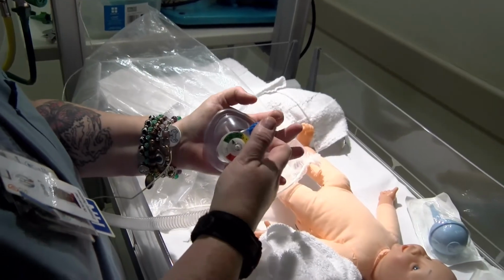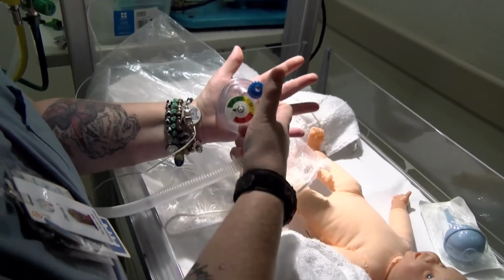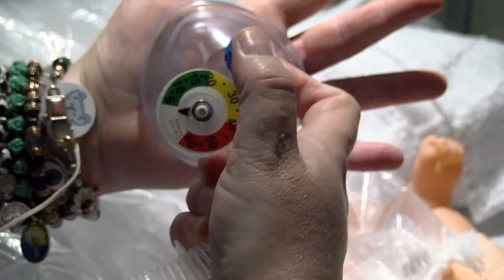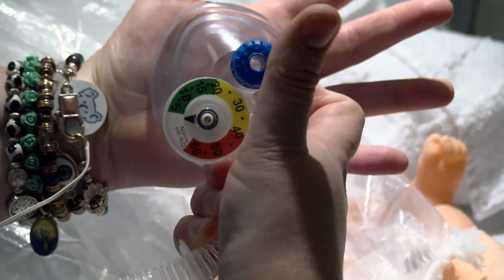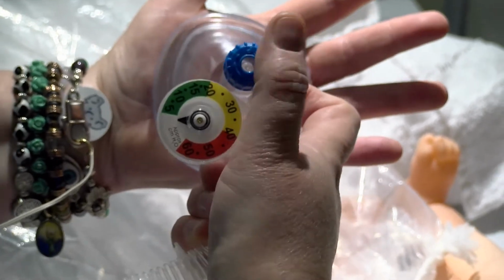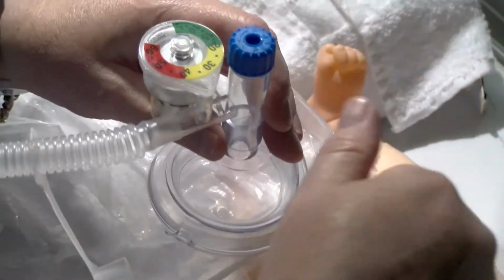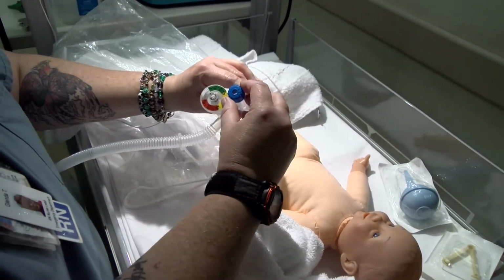And you give breaths. There you go. Yeah, you give breaths by putting your thumb over this blue thing and occluding it. And you look for chest rise. If for whatever reason the child's heart rate is not going up with giving breaths, they're not pinking up with giving breaths, you will adjust your PEEP.